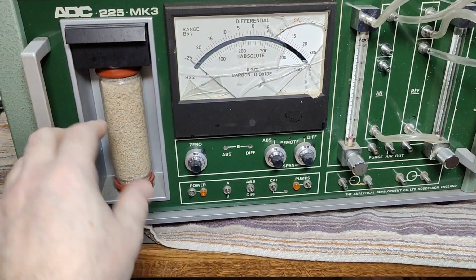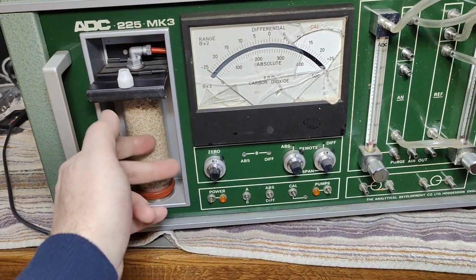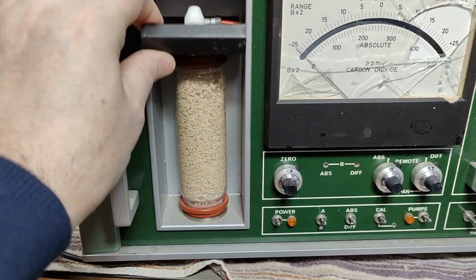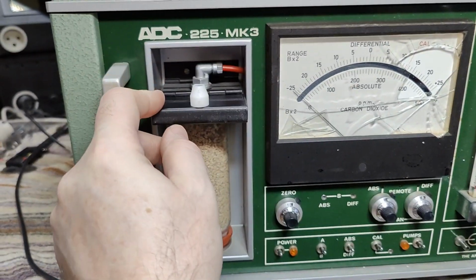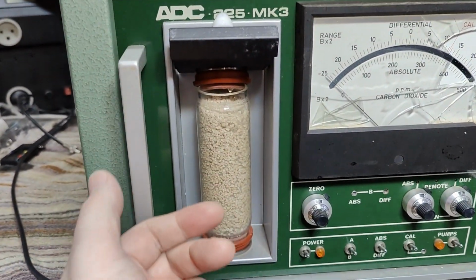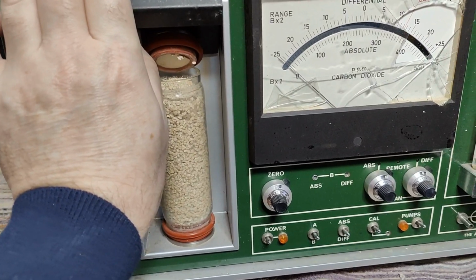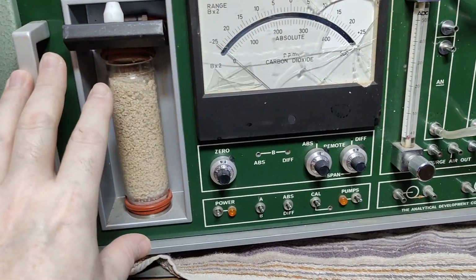I think I will start by removing, see, there's a filter here, and I think somehow you can pull this out and then replace the filter material, because I don't want this to fall down on my floor here or contaminate everything here. I haven't yet figured that out, but it was not supposed to, see, that is how it's done. Obviously, it's not supposed to be difficult, right? So there's a locking here, and then you remove the lock, and then you push this up. And then out comes the filter material.